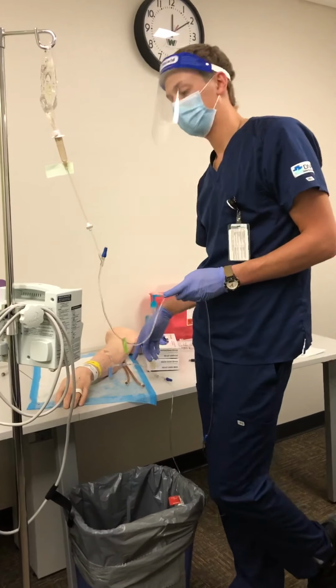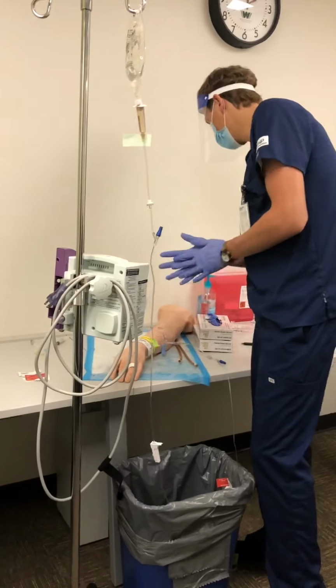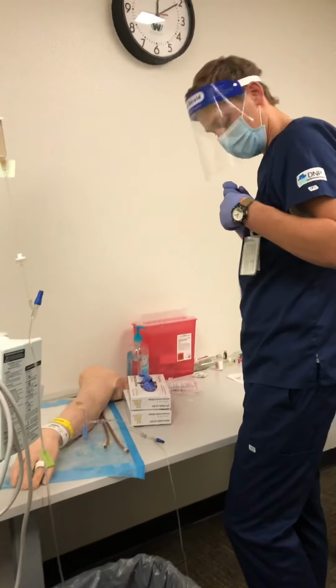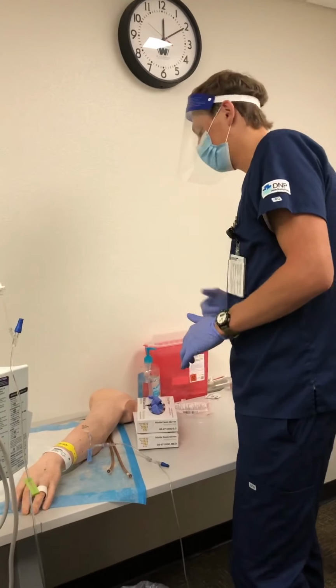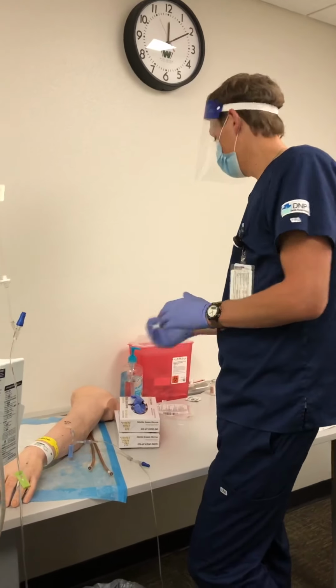Okay. So we're going to make sure that the site's not infiltrated or anything. We're going to make sure the patient's comfortable, if they have any questions for us. And then we're also going to make sure that they have their call button in place, and then we can exit the room after taking our gloves off, washing our hands in the next room.